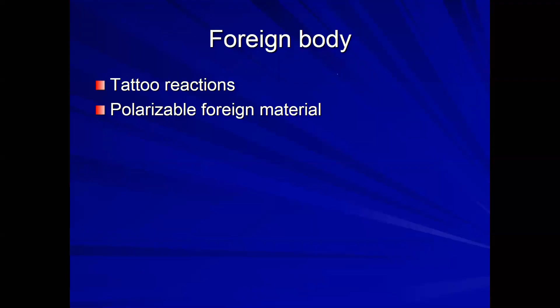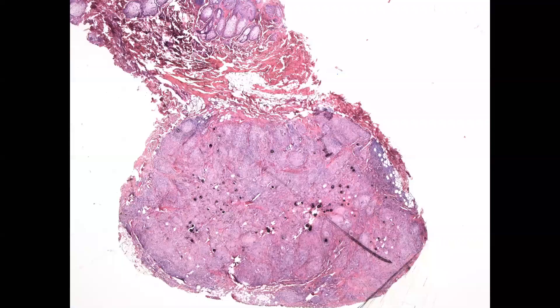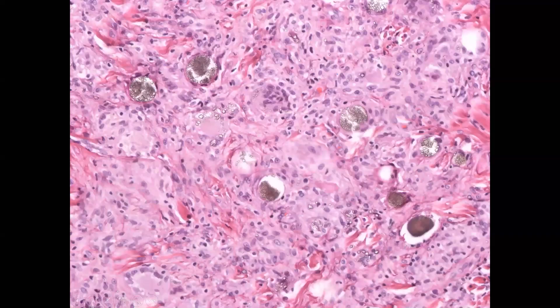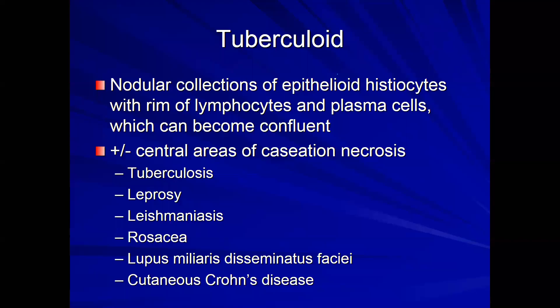Foreign body granulomas can show tattoo reactions or polarizable foreign material. In this particular case, you have nodular collections of histiocytes filled with foreign material — calcium hydroxyapatite, which is Radiesse. This is a Radiesse granuloma.